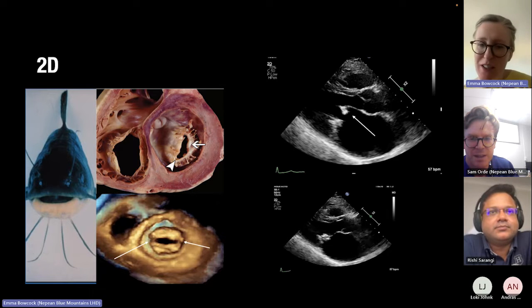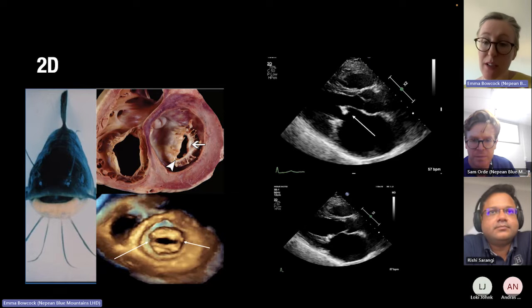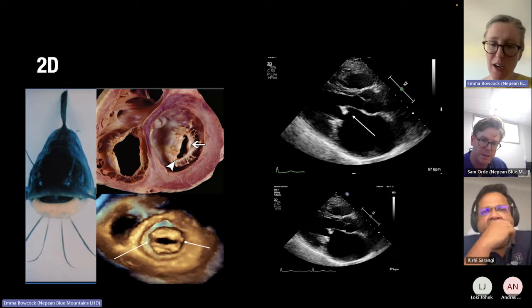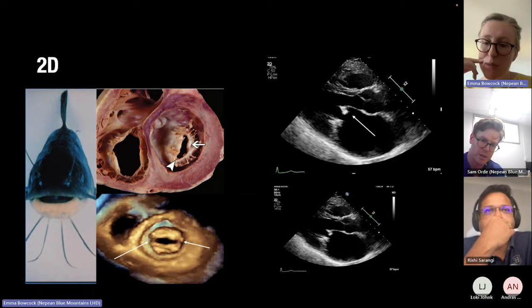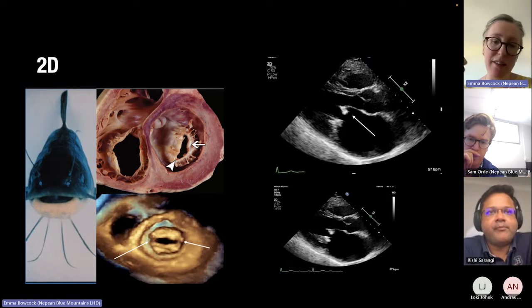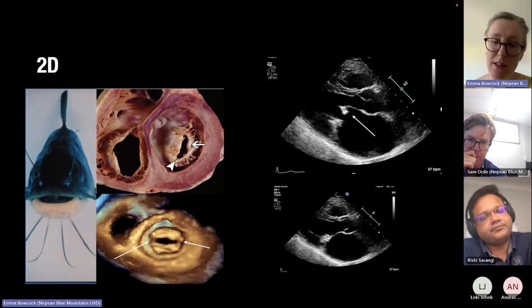Yeah, and it's got all the hallmark features of rheumatic mitral stenosis, hasn't it? It's lovely. Some of the key things to look for is this keyword that you mentioned, that doming of the thickened anterior mitral leaflet towards the left ventricular septum. That hockey stick appearance is just classic of rheumatic mitral stenosis. And as it's opening, it collects the blood, so it's like a sail in the wind, if you like. That's why it hockey sticks towards the left ventricular septum. So that's classic, what you would see on a parasternal long axis.